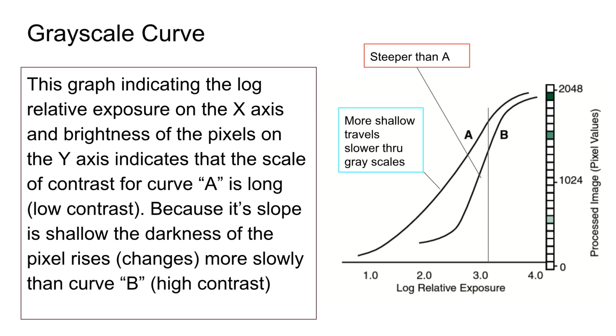Now, of course, this is happening after you already have created an image. That pre-processing has already occurred. You're just asking the computer to reprocess the image using the same algorithms it did before to try to change the contrast a little bit for you.